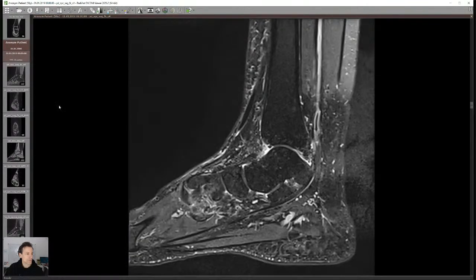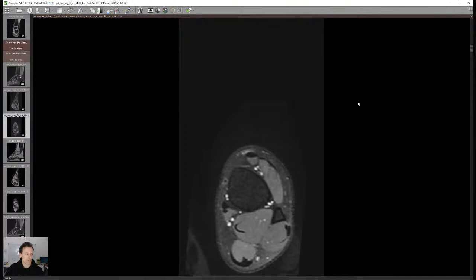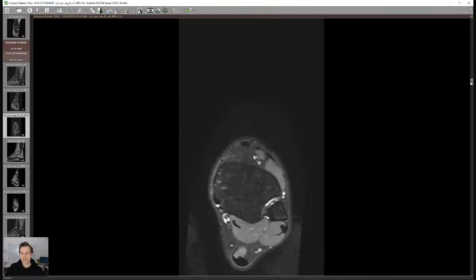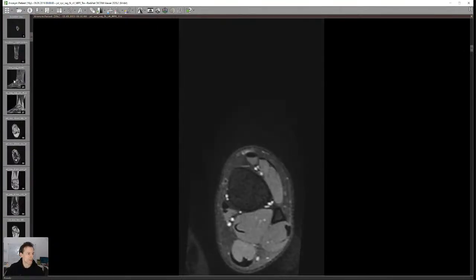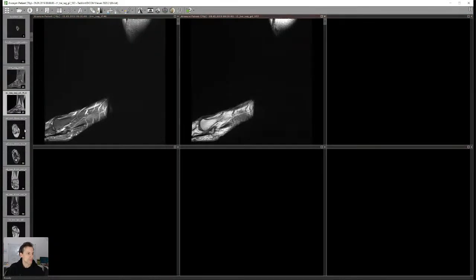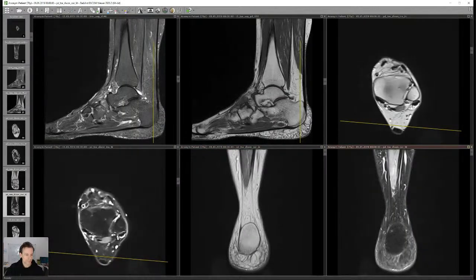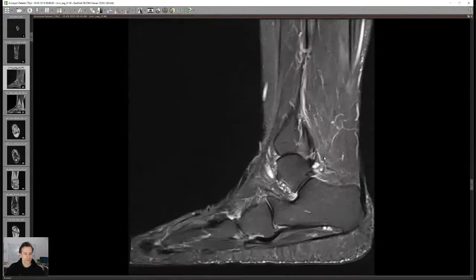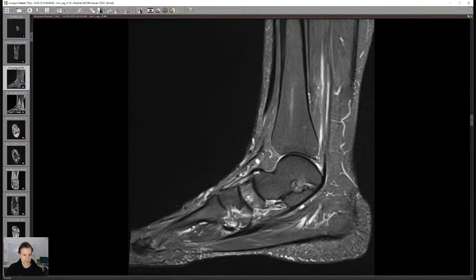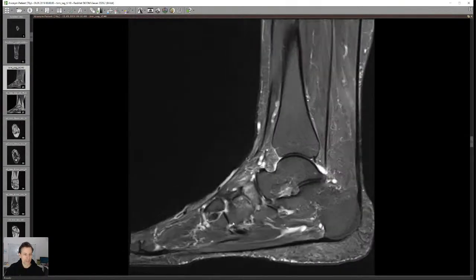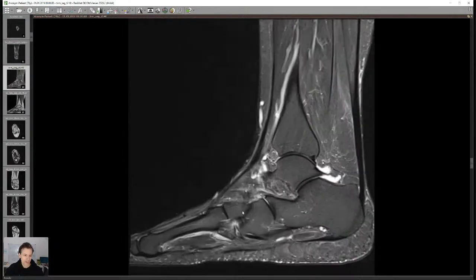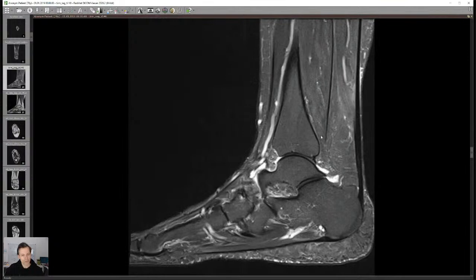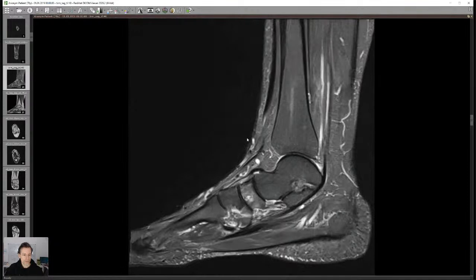Instead of just waiting for questions, I'll show you how I actually approach an ankle joint. If I open an ankle joint — let's just pick a random case — I typically start with a sagittal STIR sequence to get a general overview. You can see bone marrow edema, the state of the joints, etc. The first thing I assess is always joints, joint fluid, and bones in general.